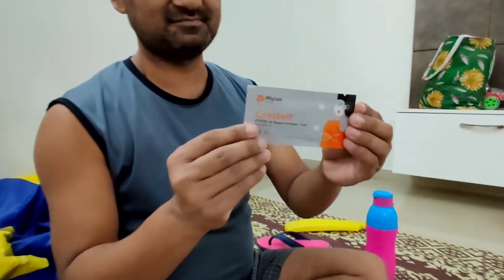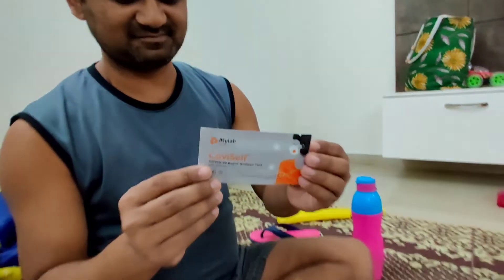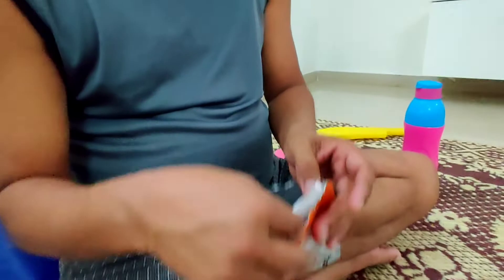This is the main kit in which you have to drop drops.